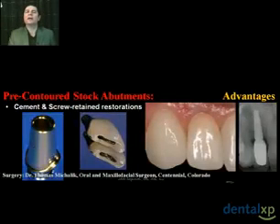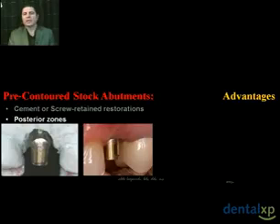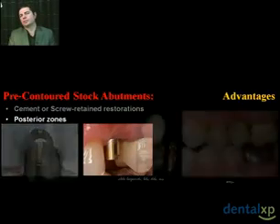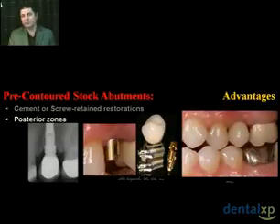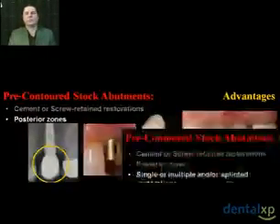So essentially you have melded every single possible technique for restoration, cement and screw retain, and also utilizing the advantages of pre-contoured components. All those advantages I talked about earlier. In the posterior zone, these restorations can be quite predictable, utilizing pre-contoured components, especially in the premolar areas, as in this case. If you look at the emergence profile of the prep abutment, it simulates ideally what we're trying to achieve in this region of the mouth.